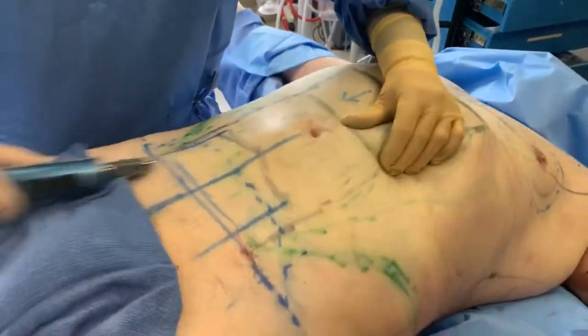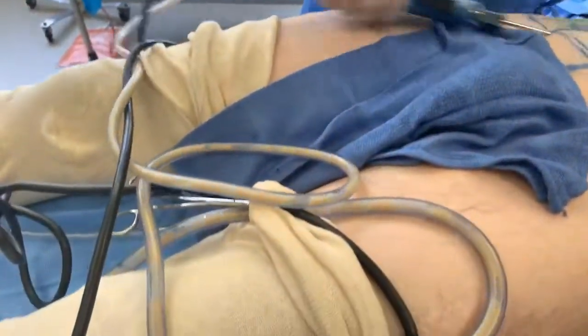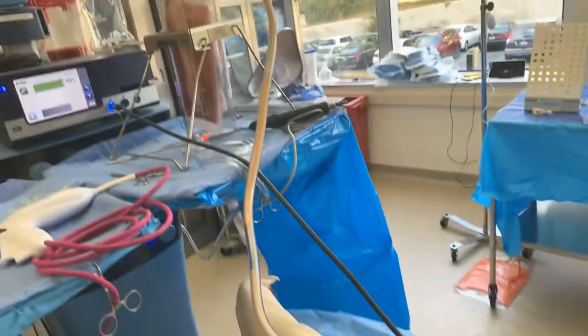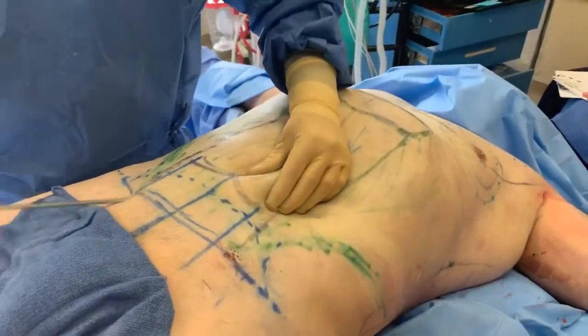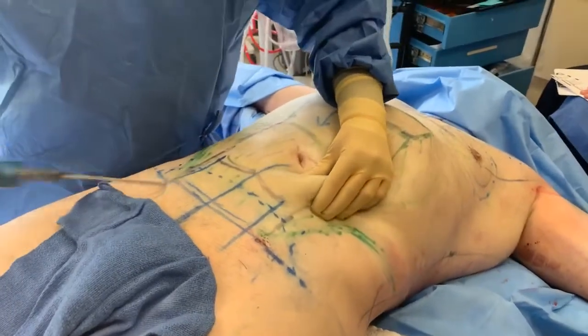We're doing liposuction now after we've already done the ultrasound and now we're removing fat. And if you take a look, the fat is very pure. It's like liquid gold. There's very little blood, oil, or debris. We're really getting down to the lower part of the stomach and getting rid of all that fat so that we can give him some shaping.